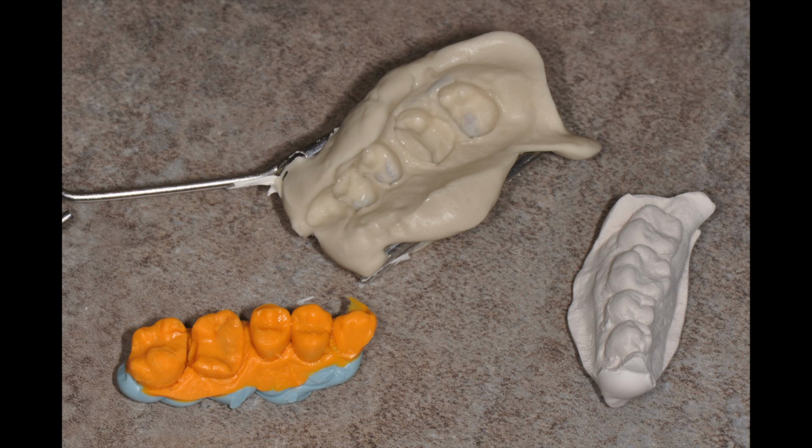Once the prep is completed and sealed, the rubber dam is removed and an alginate impression is made with the triple tray. To record accurate margins, a monoject syringe was used to deliver alginate around the preparation margins. The preparation side of the impression is immediately poured to prevent distortion, using a light body polyvinyl siloxane impression material. This will create an accurate, flexible, and workable model on which the composite onlay will be made.